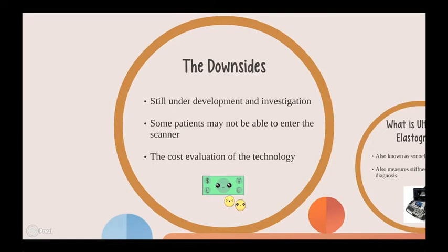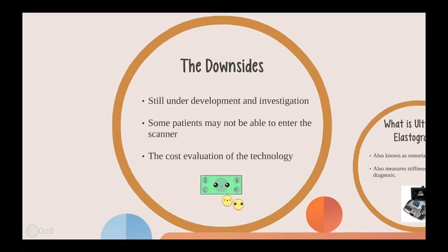Another limitation could be that patients with hemochromatosis and iron overload conditions will not have accurate results due to limitation in signal-to-noise. Also, MRE still needs to be evaluated for its cost-effectiveness.